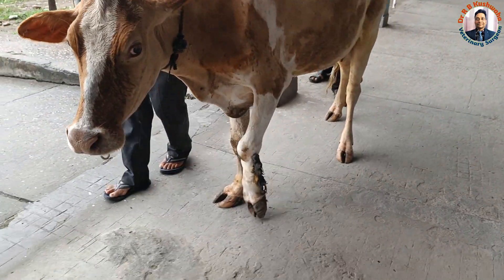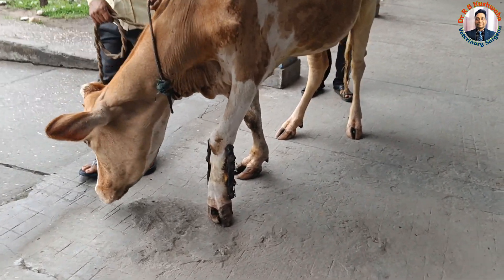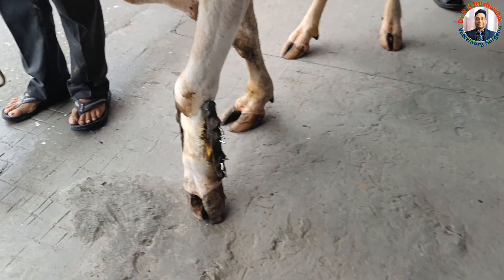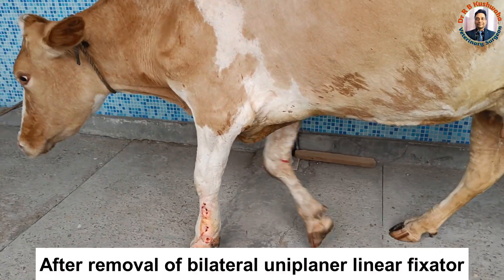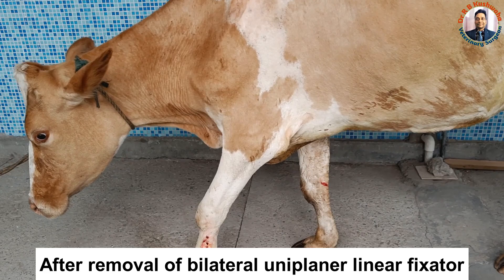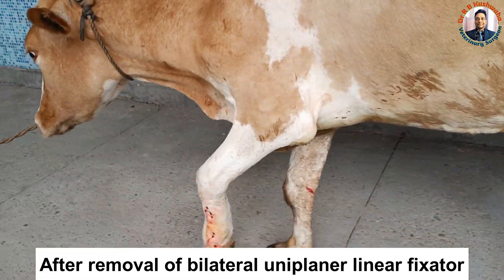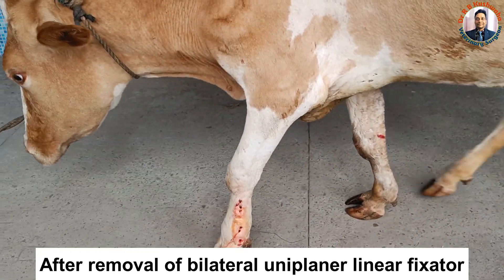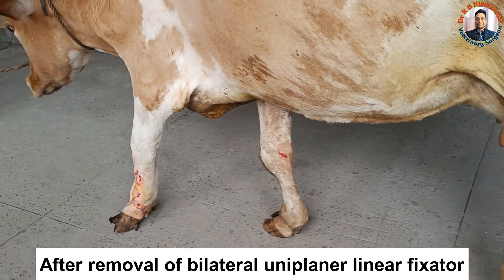We proceeded with removal of the pins. We simply cut with a pin cutter and removed the fixator. We cut from the lateral side and then pulled from the medial side, and dressed the pin tract with betadine solution.